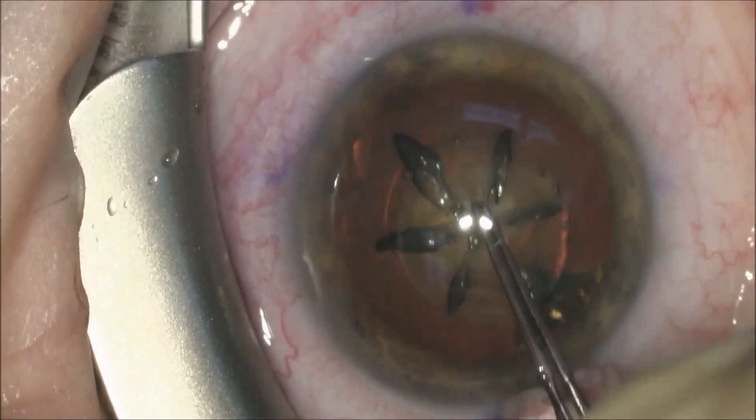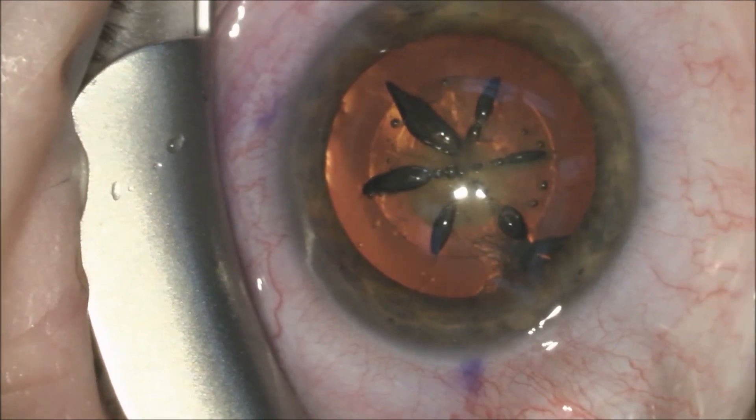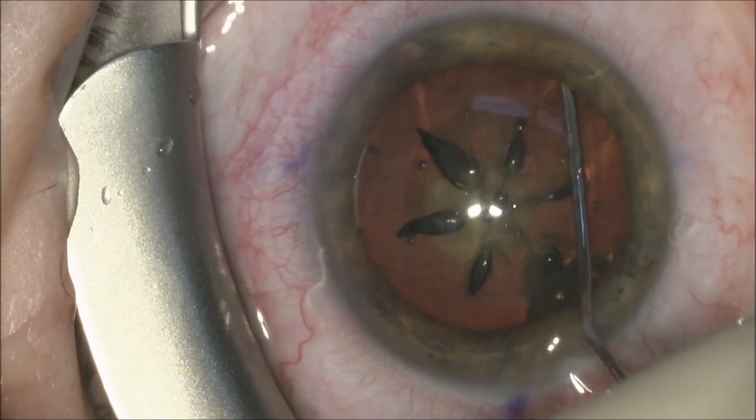We will check from all four quadrants that the capsulotomy is complete as we remove the anterior capsule. This is important because sometimes there are small tags with the laser capsulotomy.